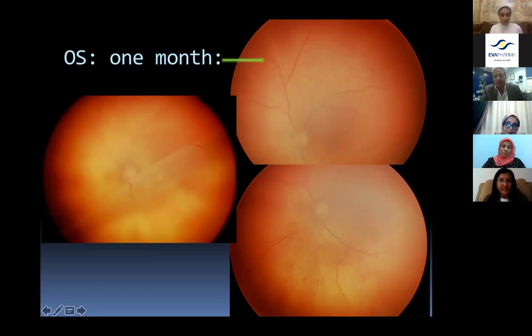So what I did while performing the vitrectomy for the first eye was give a periocular 2 mg of triamcinolone, knowing that this is not an infectious process. This is what I did, and this is how the child came a month later with a totally flat posterior segment. I was sure that if I had done a vitrectomy in such an eye, I would have lost the eye easily, because of the need to flatten it out and do peripheral retinotomy, and the sequelae of such a procedure in an eye with a very firmly attached posterior hyaloid. So for the luck, for the good intuition, the 2 milligram periocular triamcinolone did the job and the child did really well. Or maybe this was the act of God, I don't know.